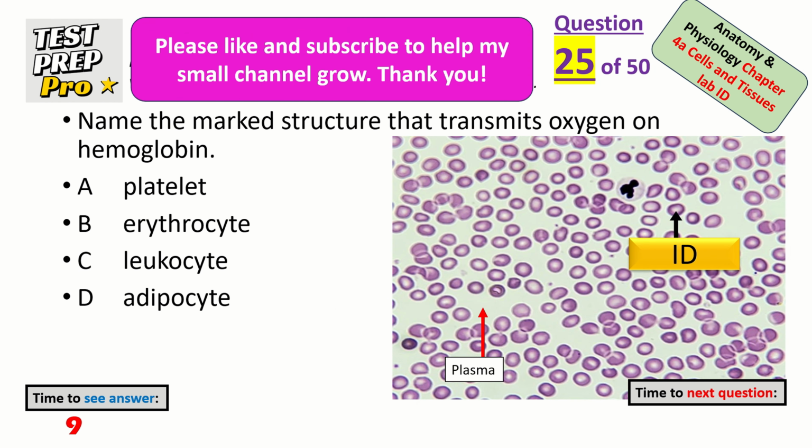Name the marked structure that transmits oxygen on hemoglobin. It's pointing to a pale kind of reddish pink cell with no nucleus. Erythrocyte.